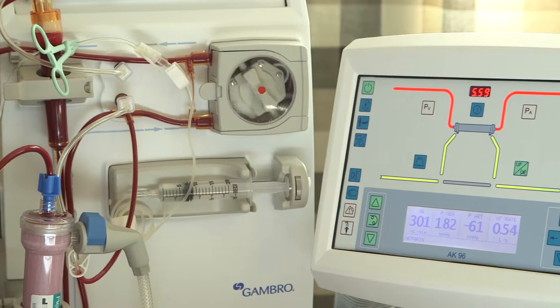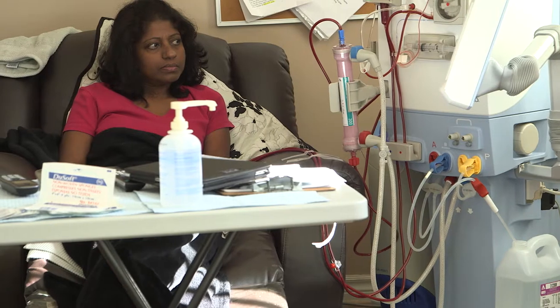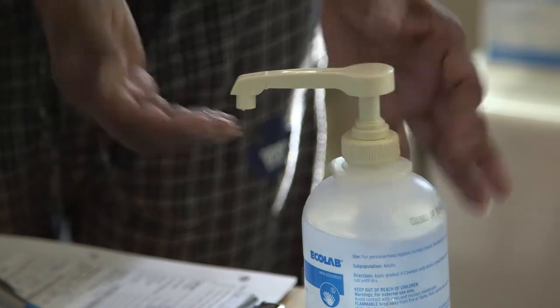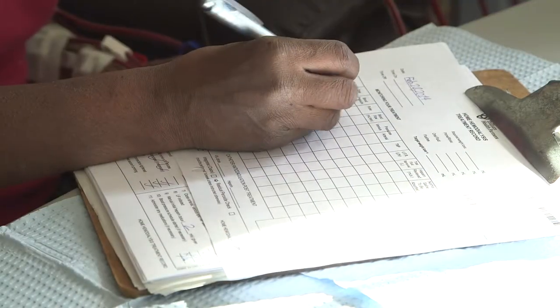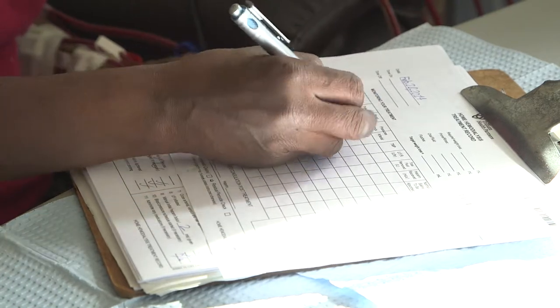Hemodialysis means to clean the blood. The machine draws the patient's blood from the body and passes it through a dialyzer that performs the function of a normal working kidney. The exchange process begins with the patient performing necessary infection prevention steps, including thorough hand washing and drying, avoiding germ-prone items, frequent use of hand sanitizer, and cleaning of access points. Key vital information is logged for patient or healthcare team review.